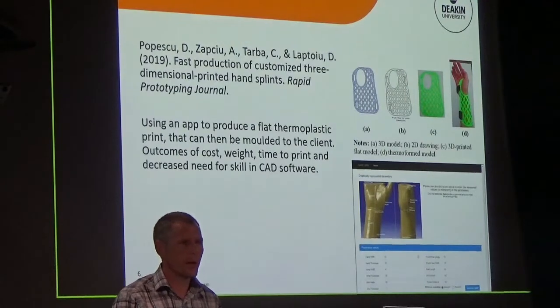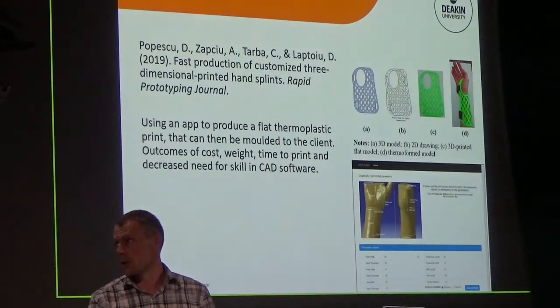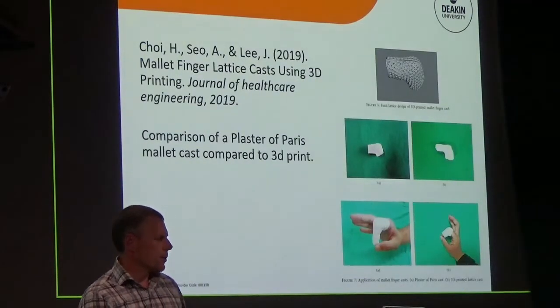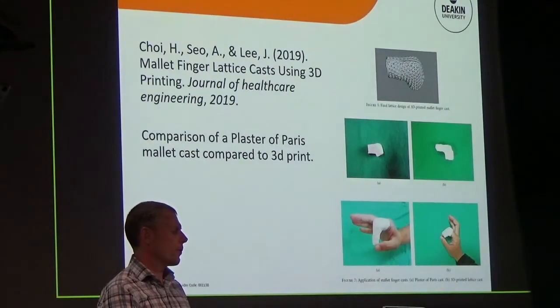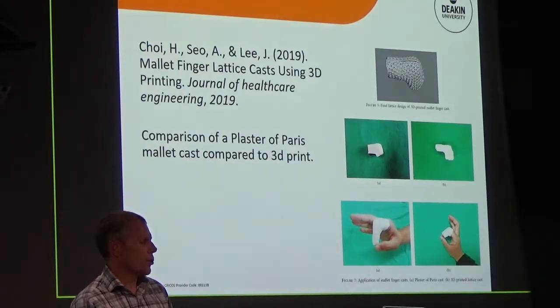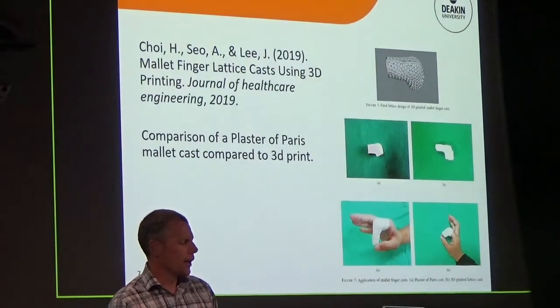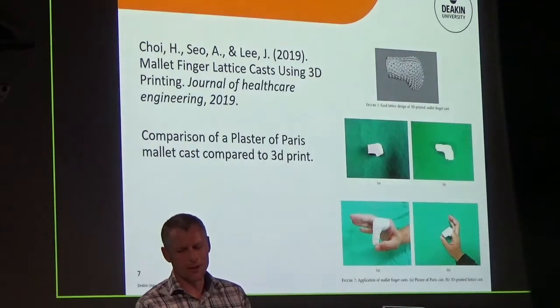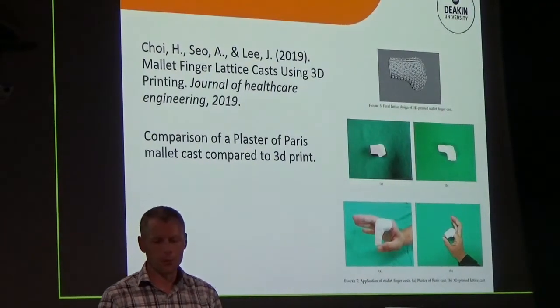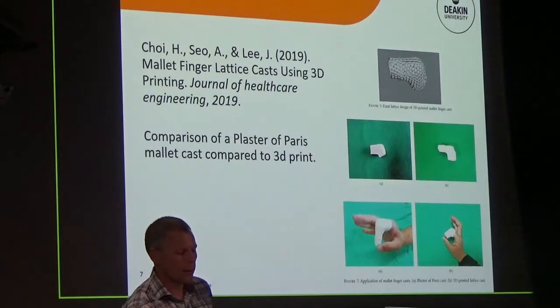So that's available through an app, and these people have looked at both the process of doing that computer software, as well as then actually getting the material onto a person. It takes a bit of skill to then mould a splint, as you guys all have. This is an interesting one in regards to they were using plaster of Paris for a mallet cast compared to a lattice or a 3D splint or print, and just showing the differences between plaster of Paris and a plastic splint. Really interesting in itself of how they're managing mallet fingers. There were lots of reading and interesting components that internationally, when you read these things, you go, well, that's a different approach to doing things than we might do here. So that bottom left corner of the A is how they manage mallet fingers with a plaster in that position. So anyway, the comparison between those two.